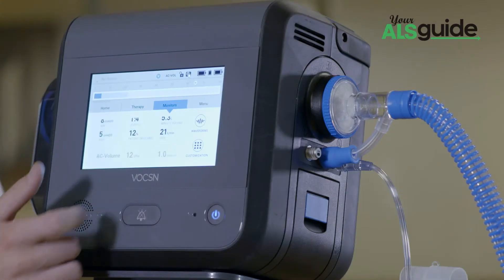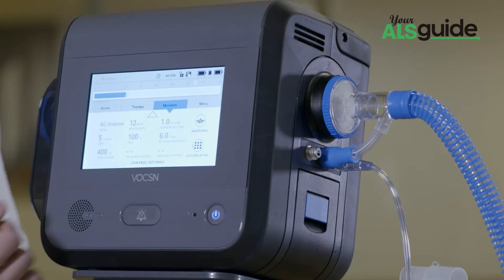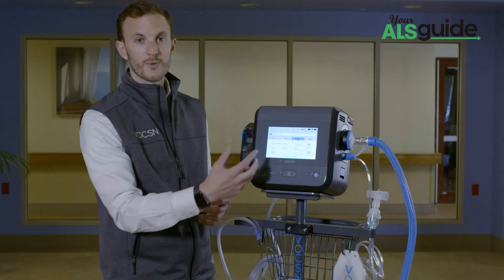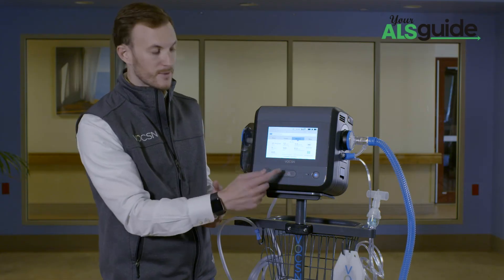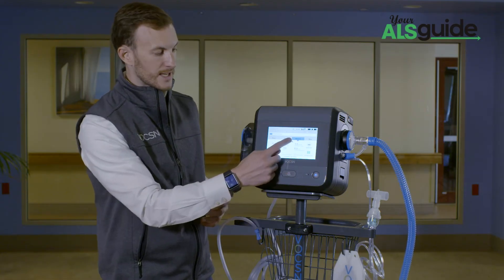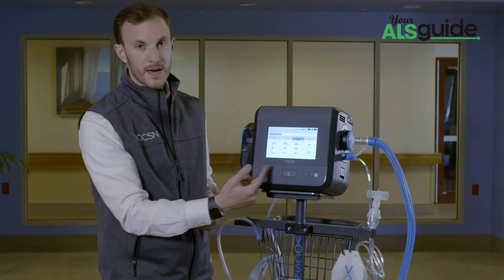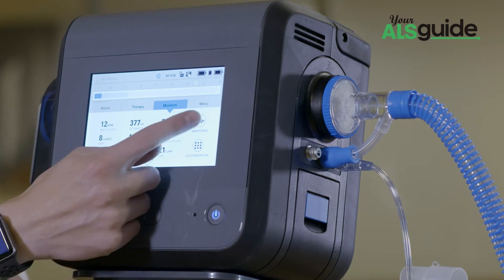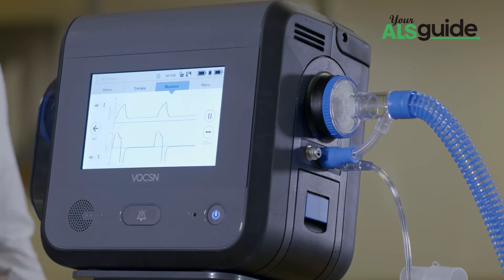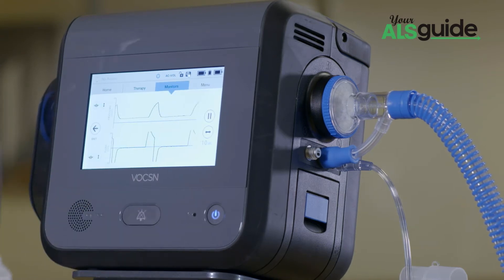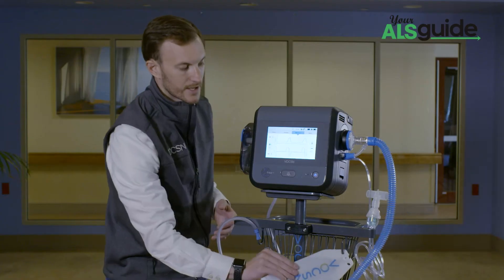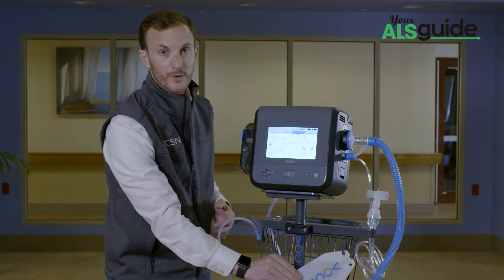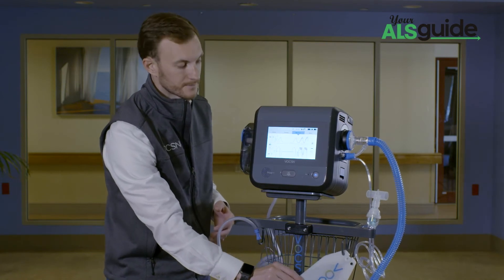I can also tab down and see all of my patient settings — what have I set for my patient? Tab back up to my monitors — what am I getting with my patient? Very accurate waveform, so as I play with the lung here, you can see the very responsive waveforms on the screen.